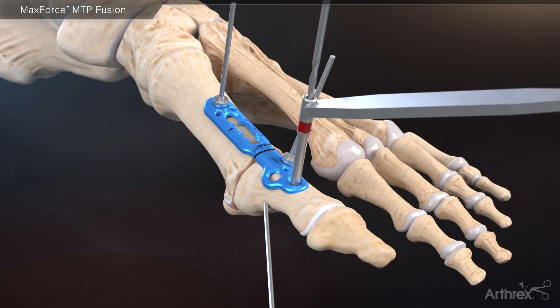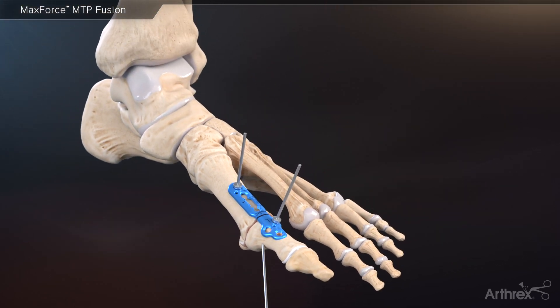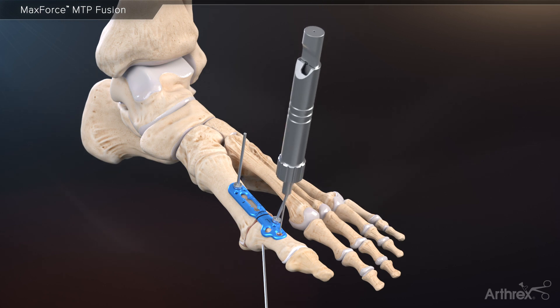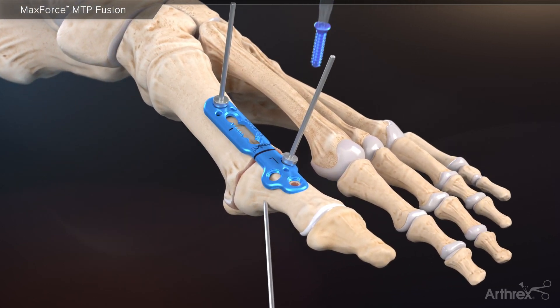Next, create a bicortical bone tunnel using a 2.0 millimeter drill. Measure, and place a 3.0 millimeter flathead cortical screw to compress the plate down to the bone. The new flathead cortical screws allow for a zero profile construct within the plate.